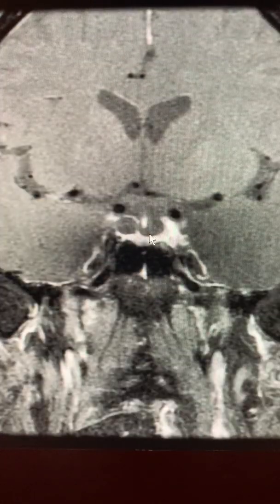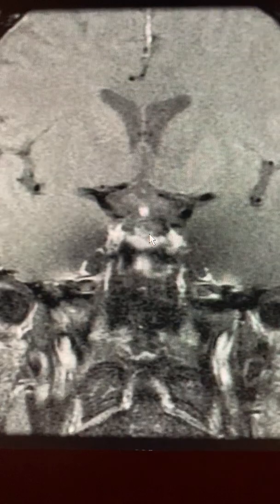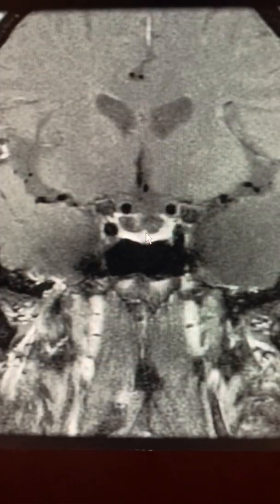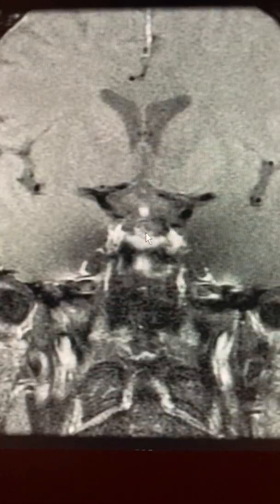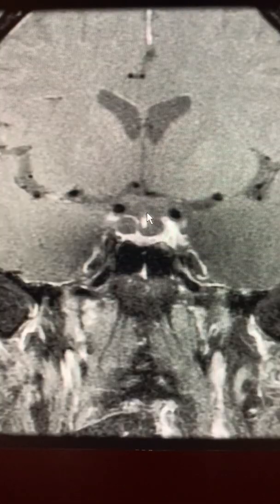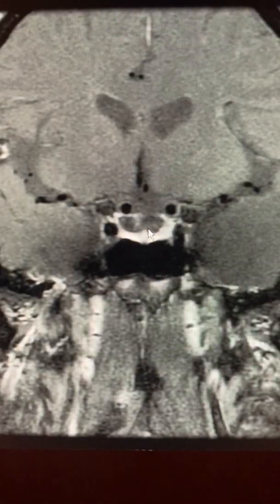Here's the pituitary gland, very small. This grayness here and there is all spinal fluid, and we see the same gray in the sella. There's a little bright signal here. Follow that and you can see that little bright signal is actually the pituitary stalk. So we have the optic chiasm here and the pituitary stalk coming down along the side of the cystic lesion.